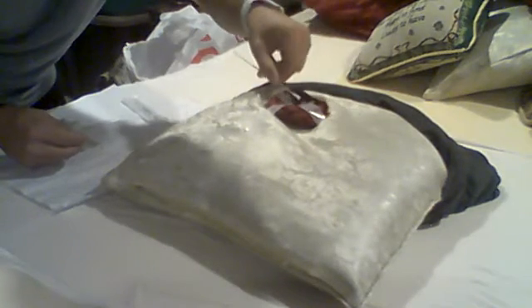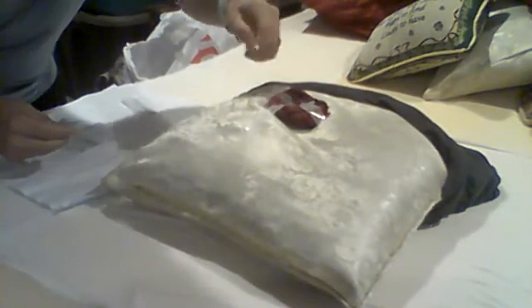So I'll check the edges. And then dispose of that. So I can go ahead and dispose of all that because I'm done with all the measuring that I need to do. So I have all the wound dimensions. There's no signs of eschar, and I assessed the tunneling with the cotton swab and got my dimensions.